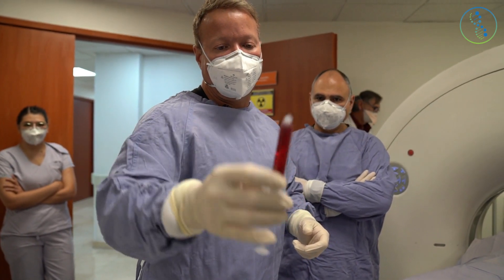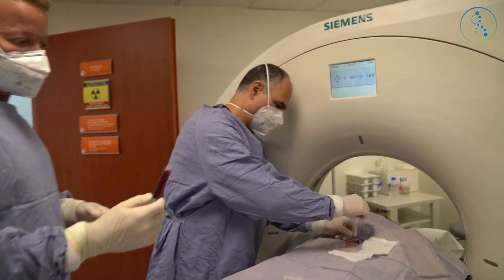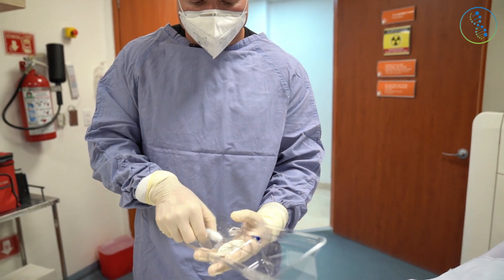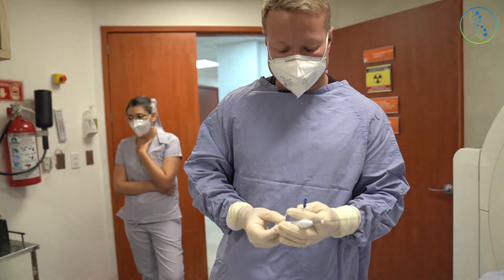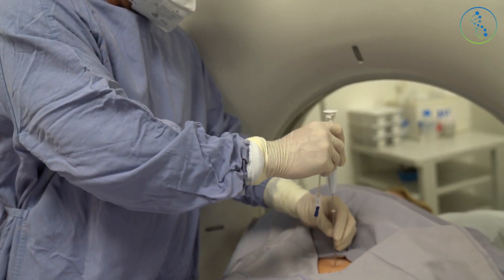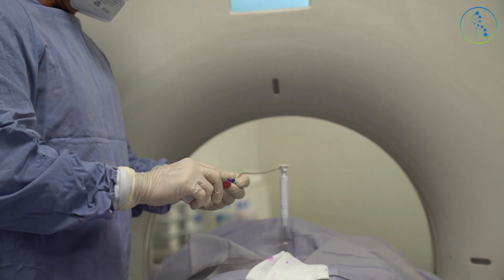Injection — we'll do a STING agonist with a COX-2 inhibitor with contrast, so that we can see how this layers throughout the tumor.